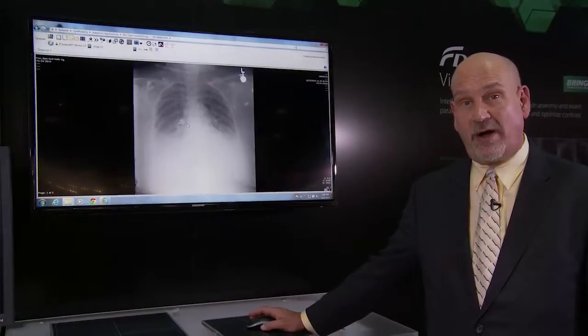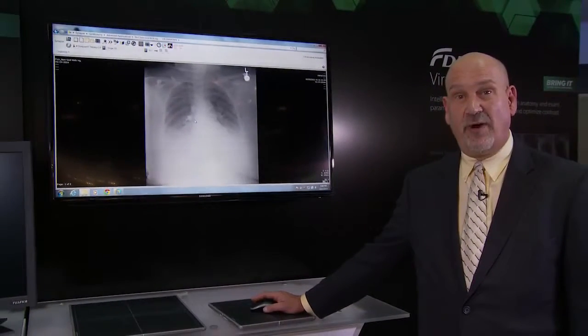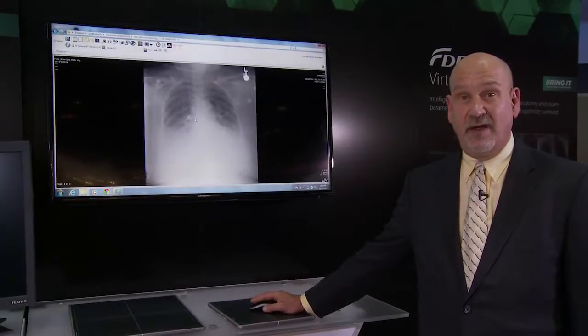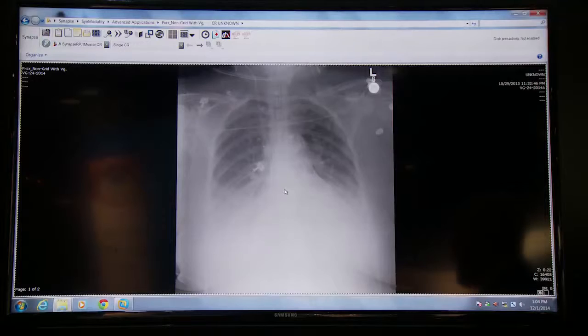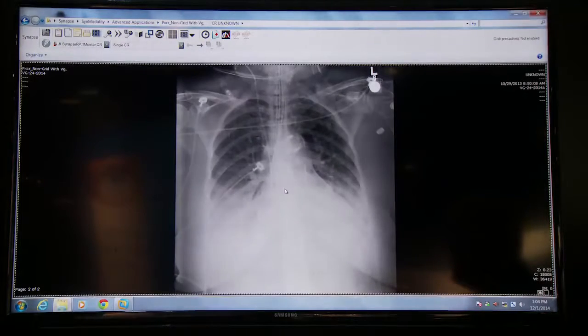This image acquired at the bedside without an anti-scatter grid can be reprocessed with our virtual grid processing, as I will show now. And there's the virtual grid result for this image acquired without a grid.